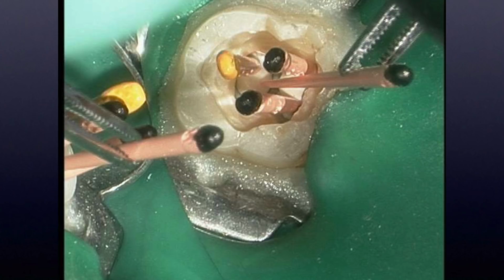I then seated each master cone to full length and confirmed full seating. In the oval distal canal, there was additional space on the sides of the master cone. So what I did is I placed additional cones to fill the space in order to prevent too much pooling of the sealer and to provide a denser looking fill.